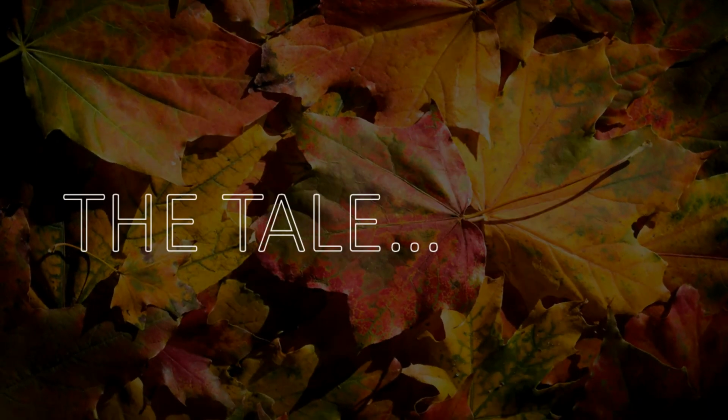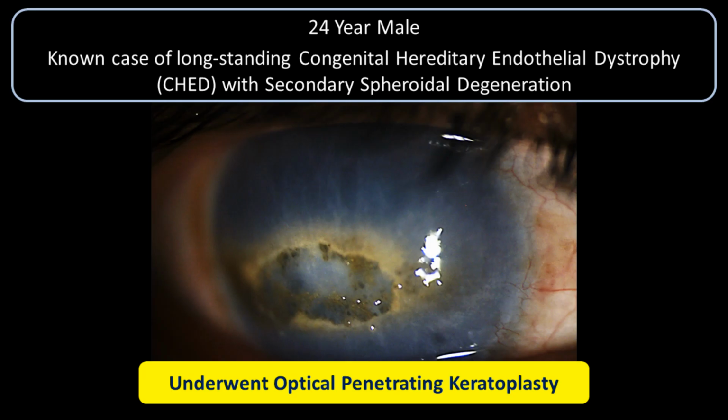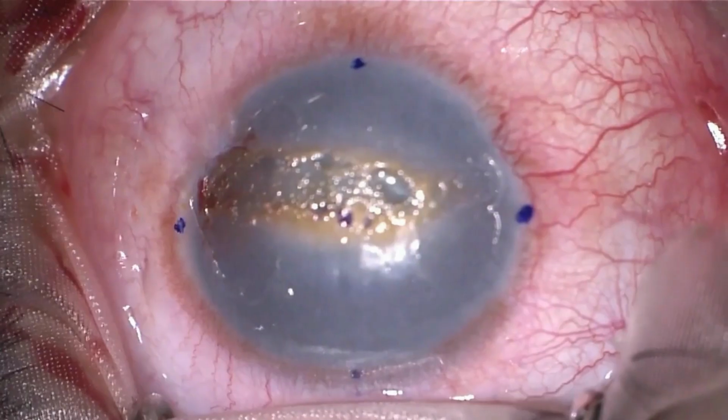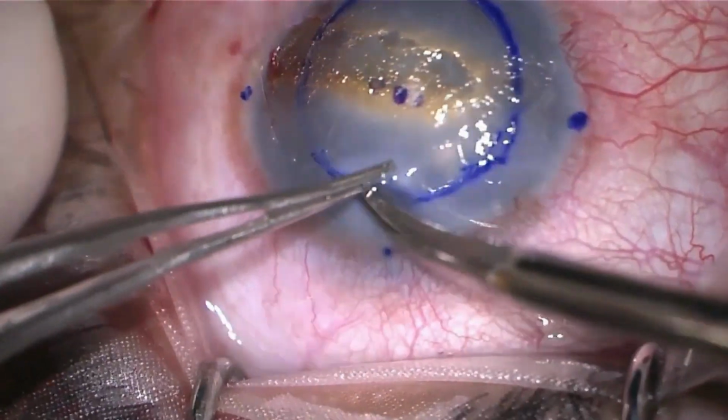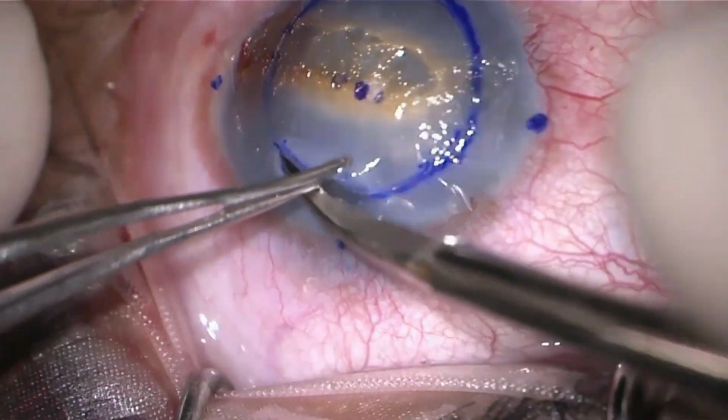The second case was a 24-year-old male who underwent full thickness keratoplasty for long-standing CHED with secondary spheroidal degeneration. Partial thickness trepanation was done and the MVR blade was used to create AC entry.